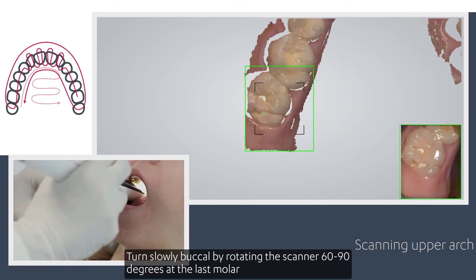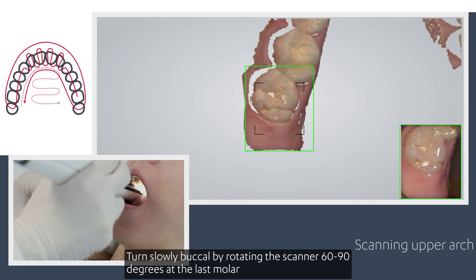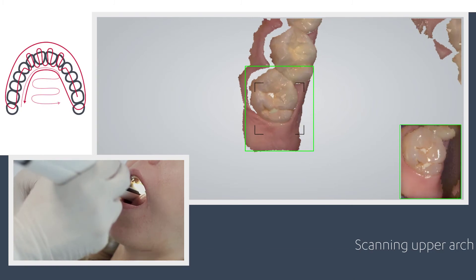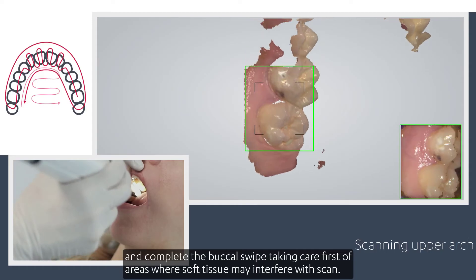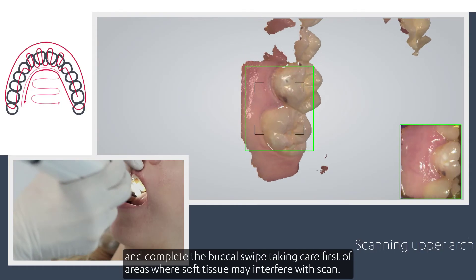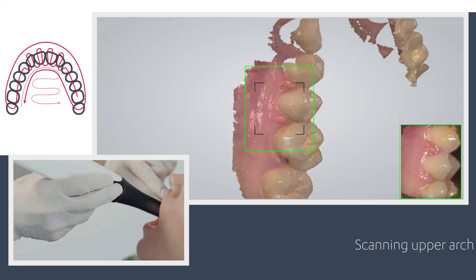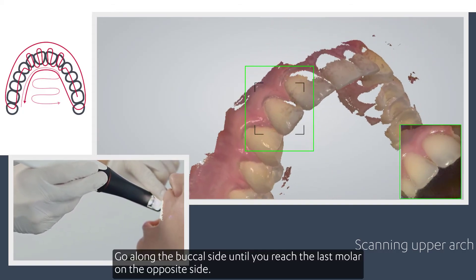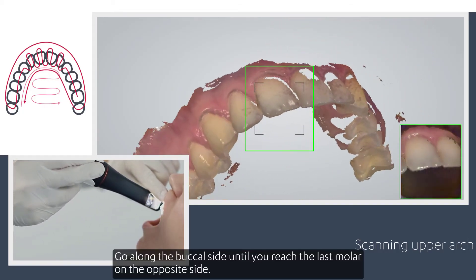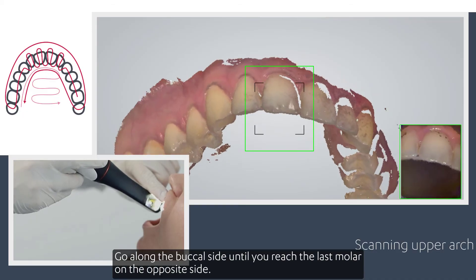Turn slowly buccal by rotating the scanner 60 to 90 degrees at the last molar and complete the buccal swipe, taking care of areas where soft tissue may interfere with the scan. Go along the buccal side until you reach the last molar on the opposite side.